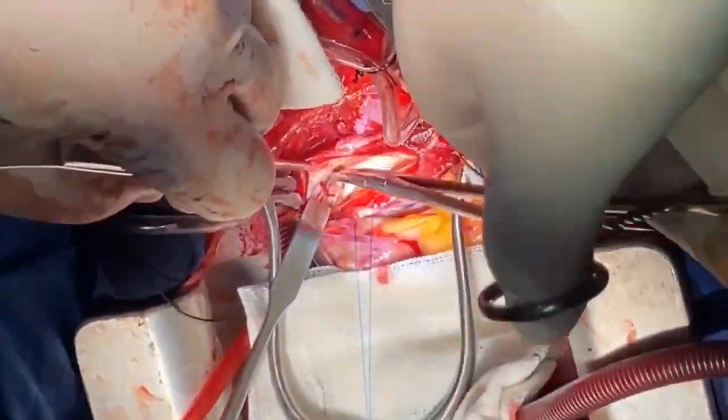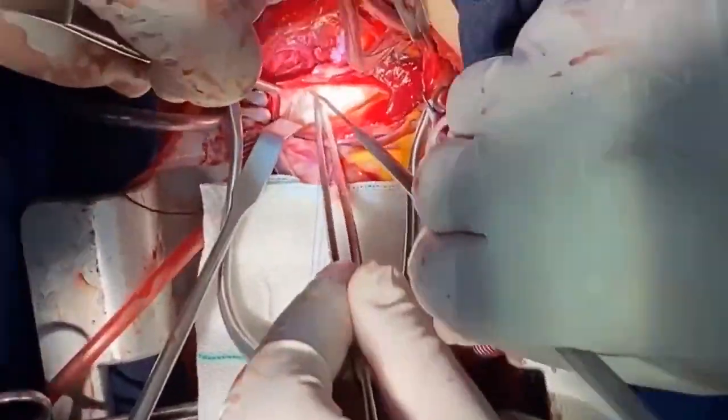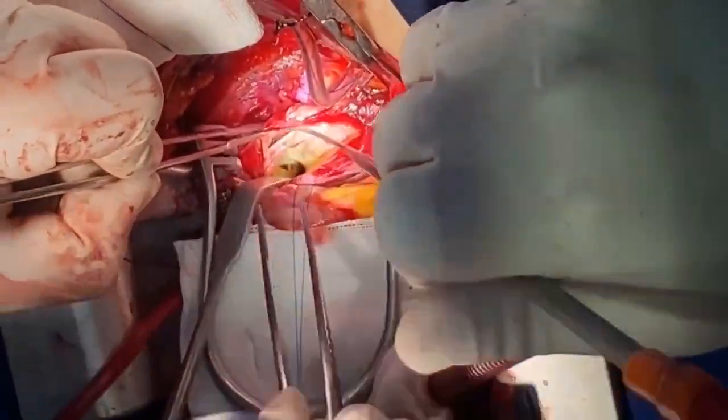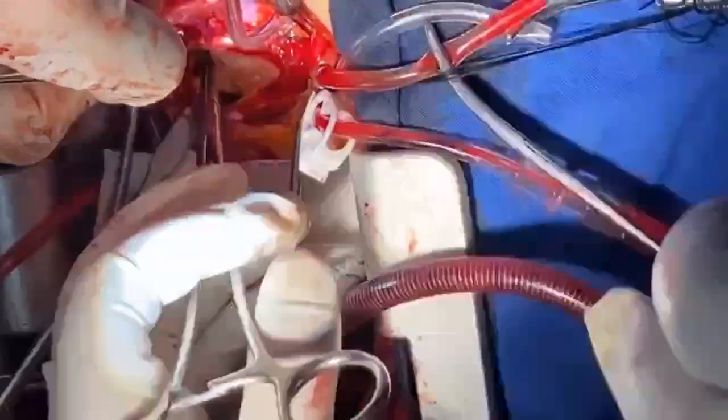I call my technique to do that the Zeraatian technique. I use a special type of retractors in order to expose the right pulmonary artery. As you can see, you can make it available in your operating theater very easily. It is harmless and it doesn't damage or endanger any adjacent tissue or organs while you are performing endarterectomy.